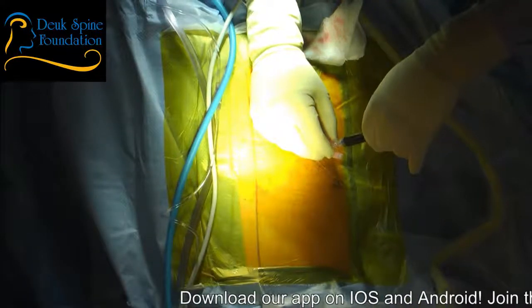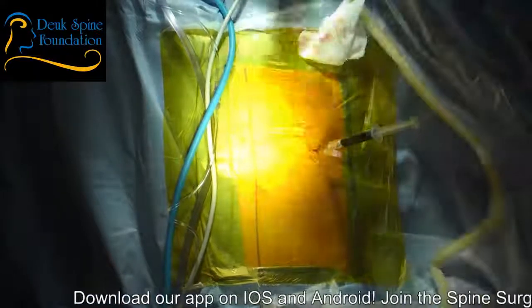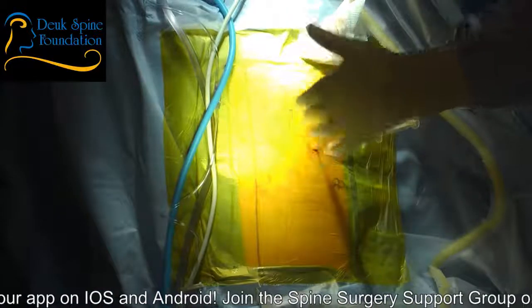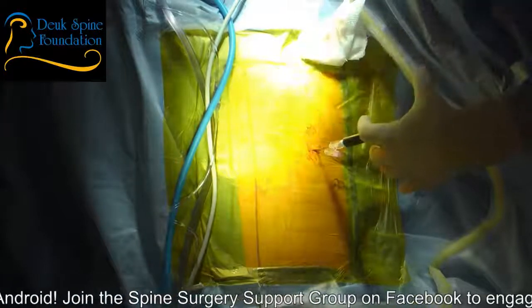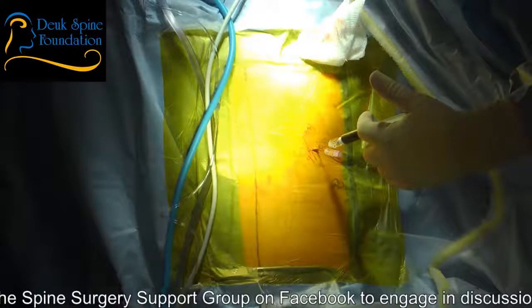All right, so I was patient. I took my time. A lot of surgeons are not so patient. It doesn't matter if they're an orthopedic surgeon or a neurosurgeon, they're just not patient. They don't wait for that right moment. And sometimes, as you could see, that window of opportunity to have this thing put in perfectly depends on time, but it also depends on location. And so I moved the needle around patiently, and I got to where I wanted to be.